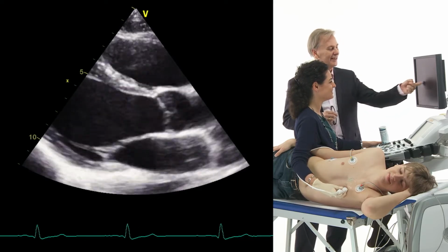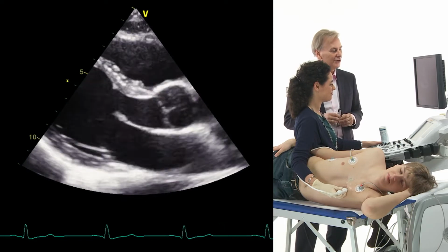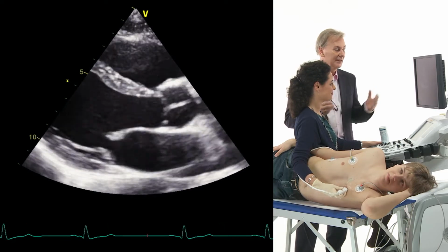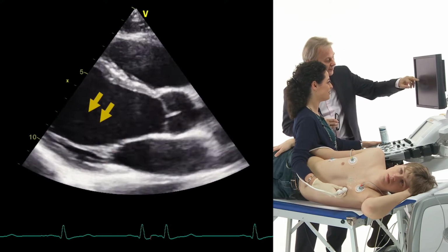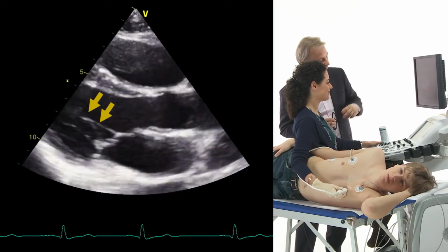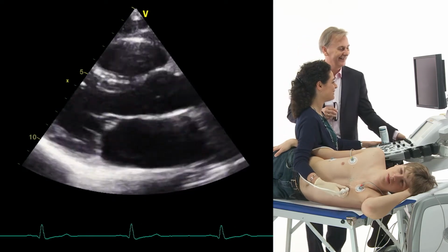But you can see that the leaflets are not thickened. You can see that the opening and closing motion is completely normal. And Anna, what is this here though? Do you see these coating structures there? Yes, Thomas, don't get scared. This is nothing but normal.